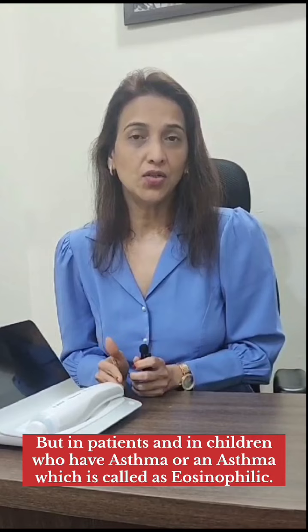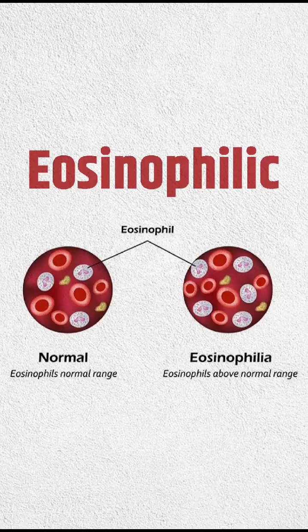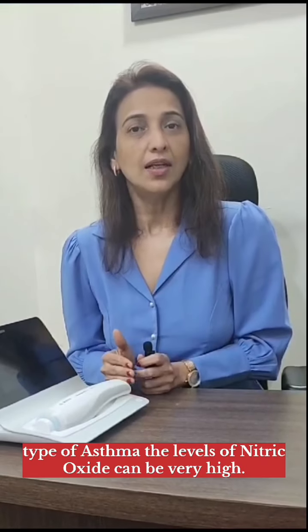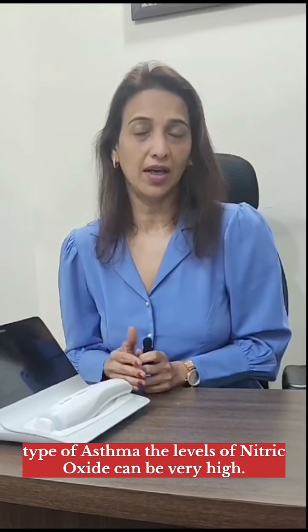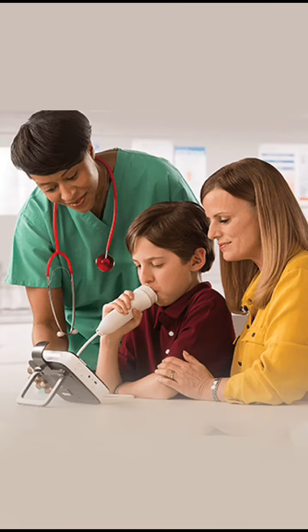But in patients and in children who have asthma, or the eosinophilic type of asthma, the levels of nitric oxide can be very high. This is done with the help of a device which is called a FENO test.